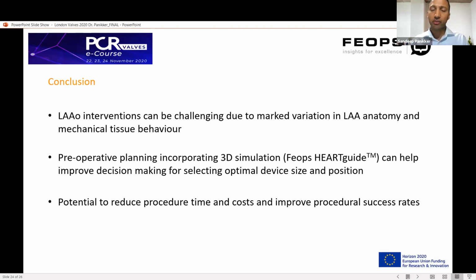But of course, pseudothrombus is visible on quite a few patients, particularly those with permanent AF. But you have to have a second pass there to make sure that there is no pseudothrombus. So the second pass is as good as looking at it on TEE. I hope that helps answer the question.